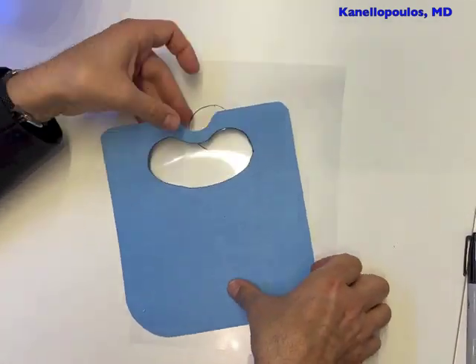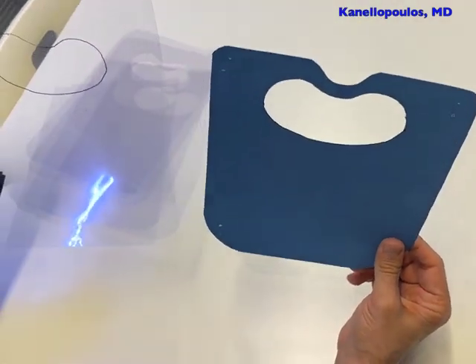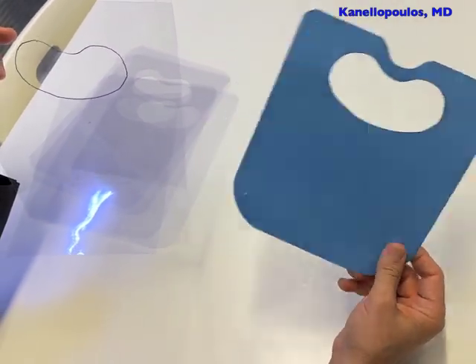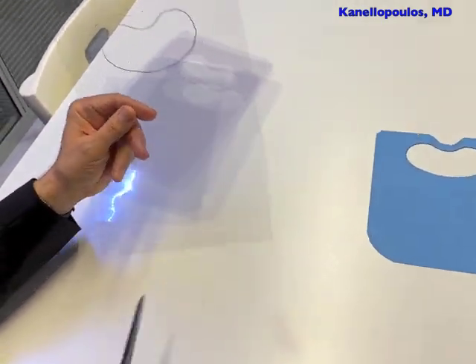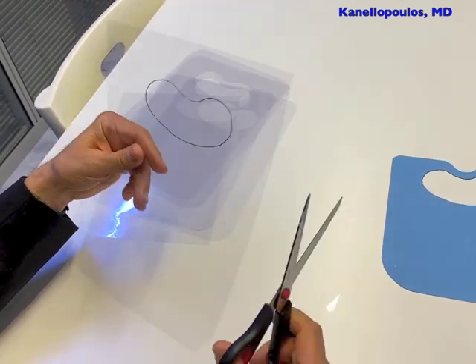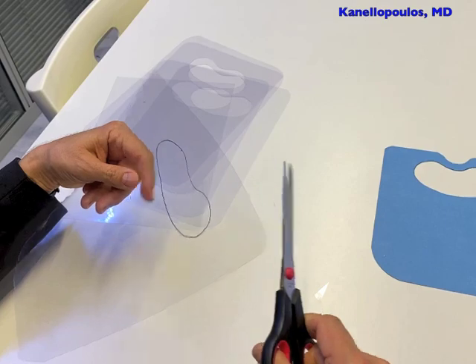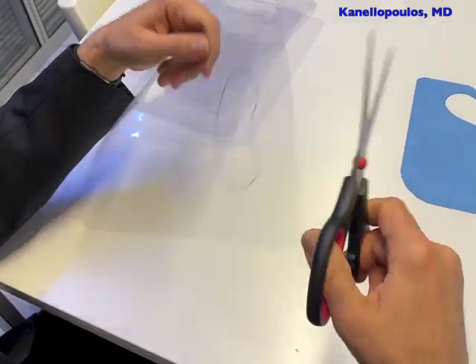I realize that the letter size is a little bit bigger than the commercially available template, but that's okay — that's a better shield. On this model, we're just going to round out the corners so we don't bump into them and get a paper cut or, God forbid, poke an eye with it. So we well-round the edges.